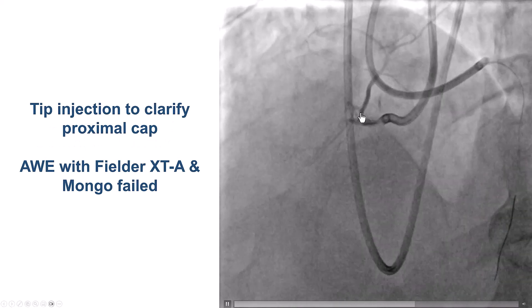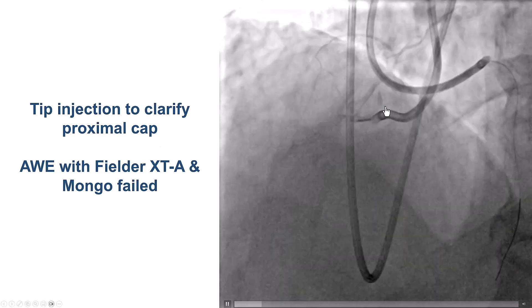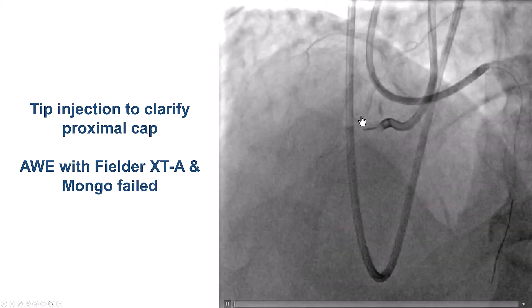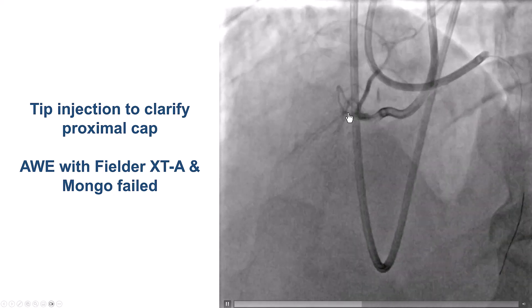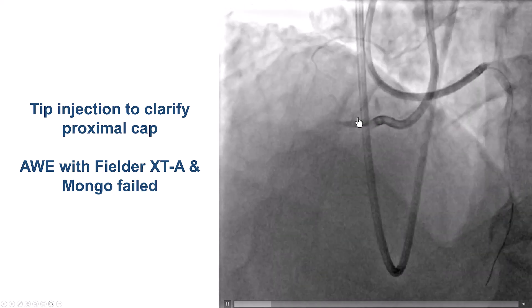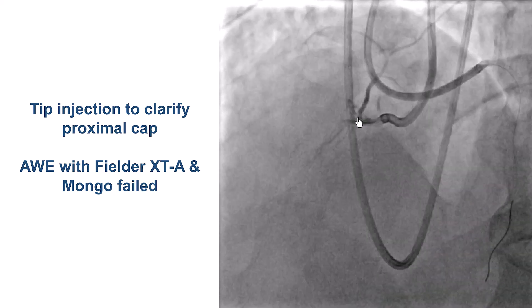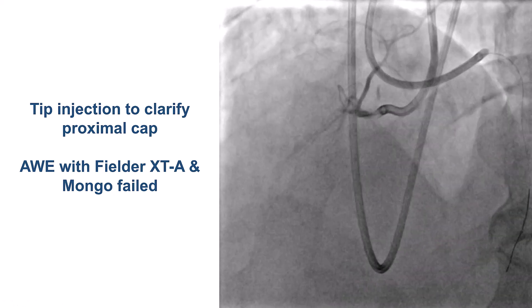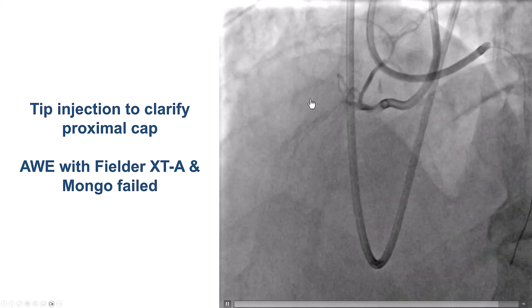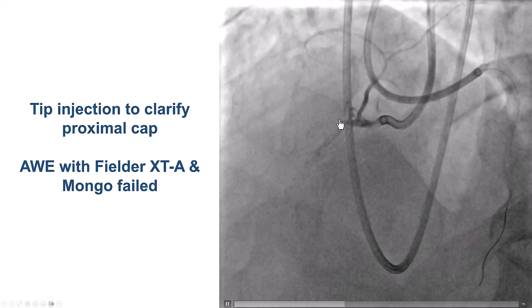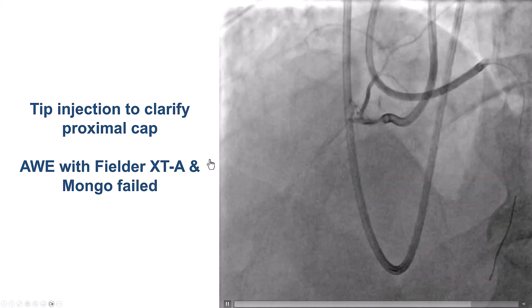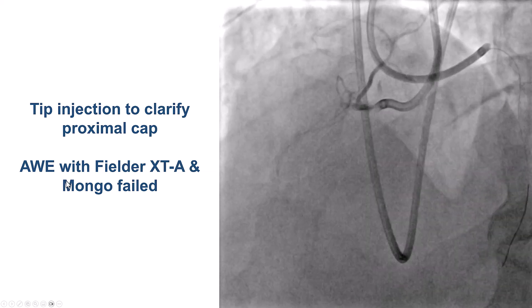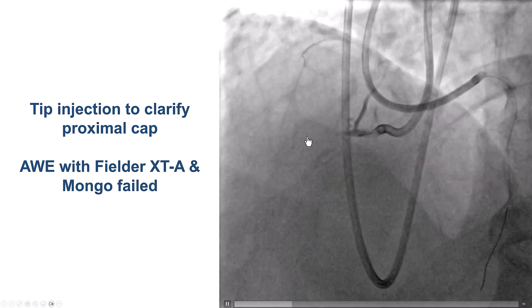We had difficulty understanding the proximal cap, in part because there was dampening of the guide. In cases like this, we can get a better sense of the anatomy by inserting a microcatheter and performing a tip injection. With the tip injection, we could see small branches coming off at the proximal cap, but there may be a tapered entry into the occlusion. We tried polymer-jacketed wires — a Fielder XTA and a Gladius Mongo — but could not get through.